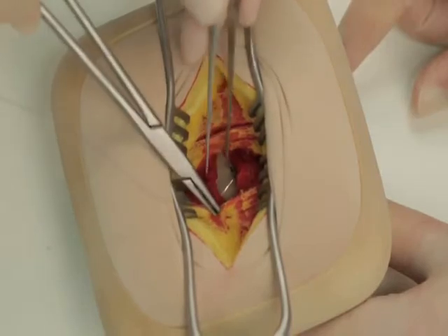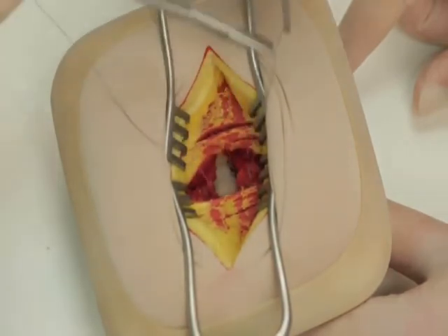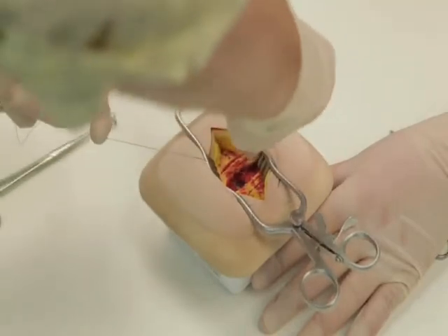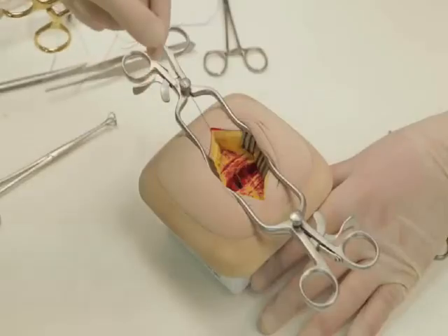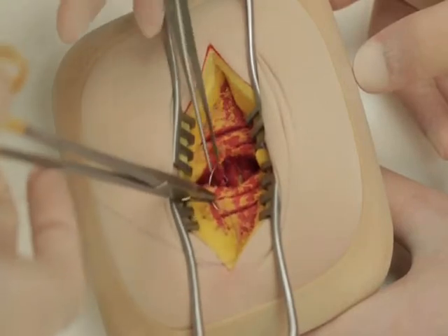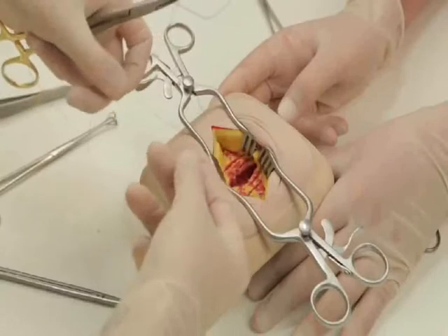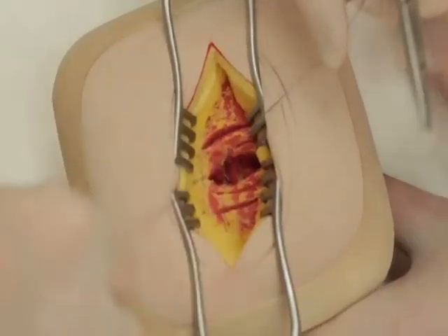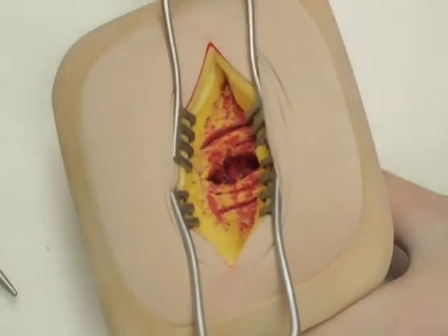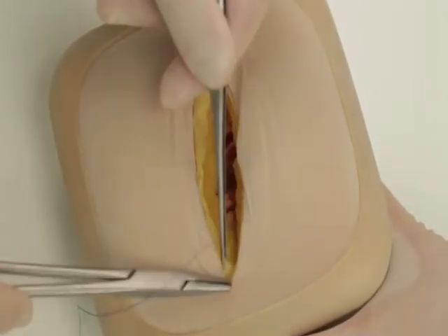Loose, interrupted 2-0 Vicryl stitches should be used to oppose the muscles, transversus and internal oblique. External oblique is closed using a continuous stitch of 2-0 Vicryl. The Scarpa's fascia can be closed using interrupted sutures.